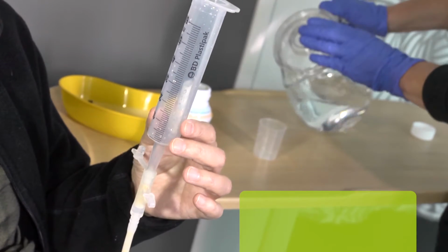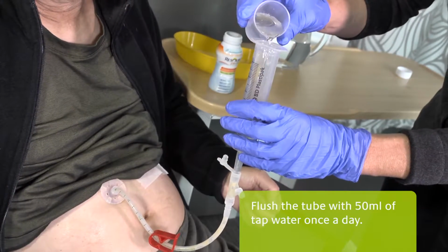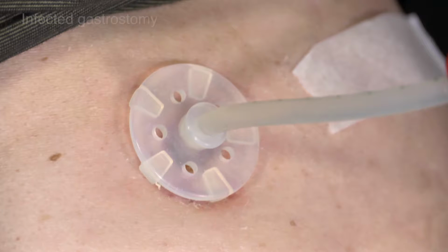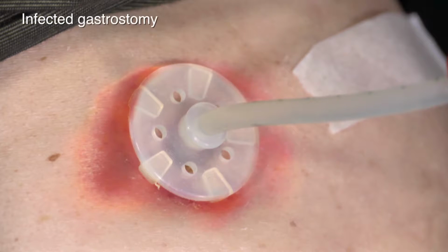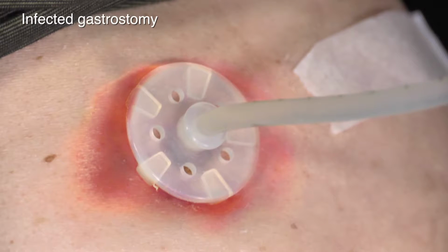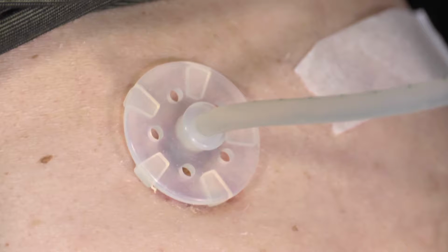You should flush the tube with around 50 millilitres of tap water once a day when it's not being used to deliver nutrition. If there is redness and/or some discharge on your skin, there may be an infection. Ask your nurse to take a look at it to provide advice on clearing the infection. Most infections get better quickly.